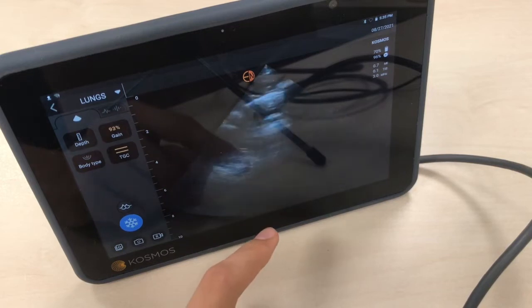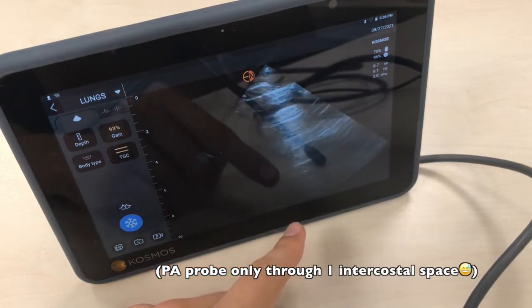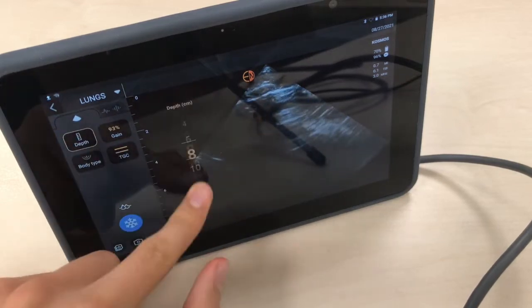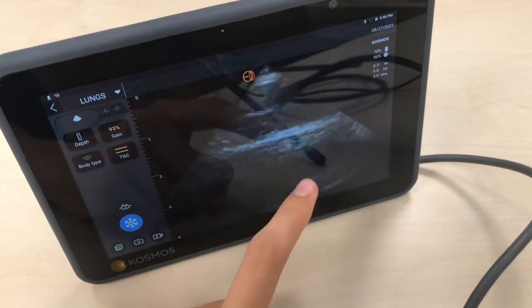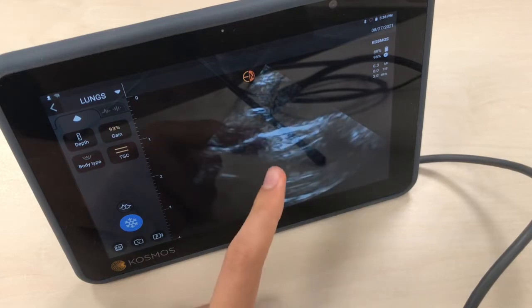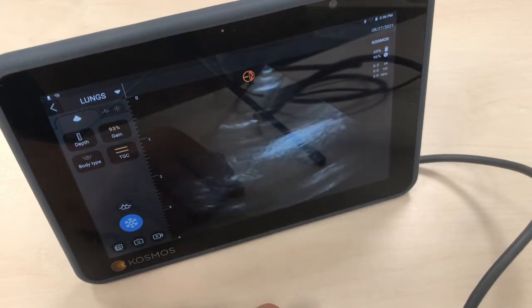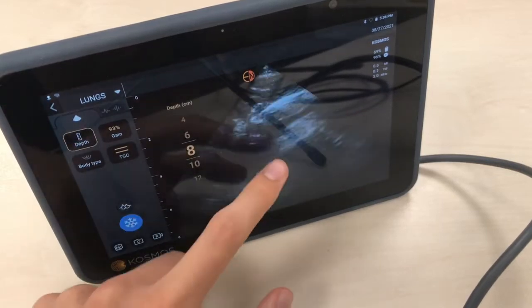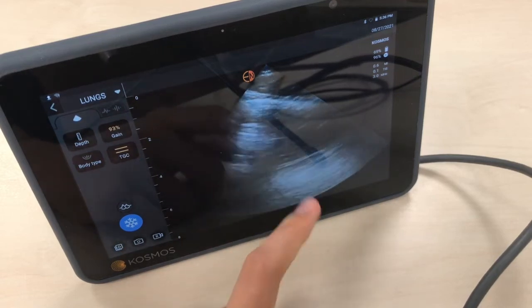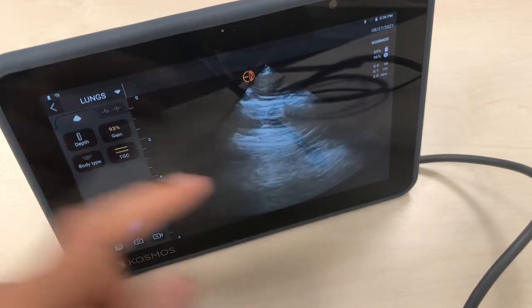Now you're seeing the lungs. Since this is a phased array probe it can go through the ribs, and here you're seeing my lung changing with inspiration. Here you have the pleural line and you can see the pleural sliding with every inspiration. These are artifacts from the air. With increased depth, here you're seeing a rib where the echoes cannot pass through, and here another intercostal space again with pleural sliding — this could be useful to rule out pneumothorax.